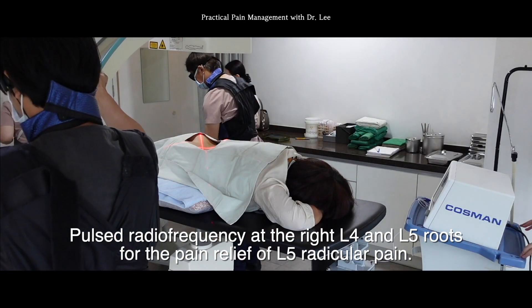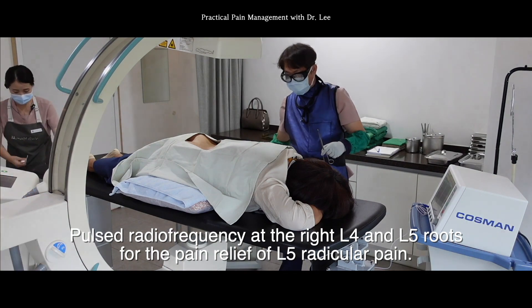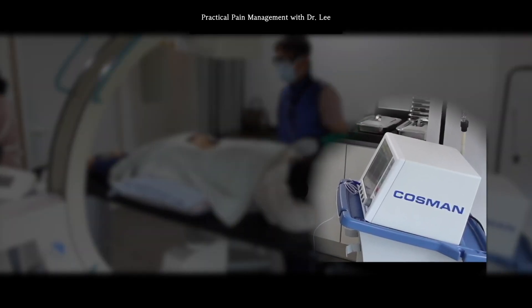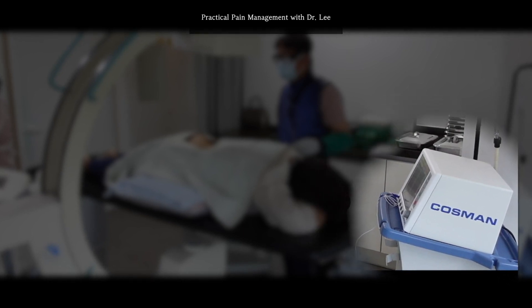This is a case of pulsed radiofrequency at the right L4 and L5 roots for the pain relief of L5 radicular pain. I'll use the Cosman G4 radiofrequency generator, which provides 4 channels.